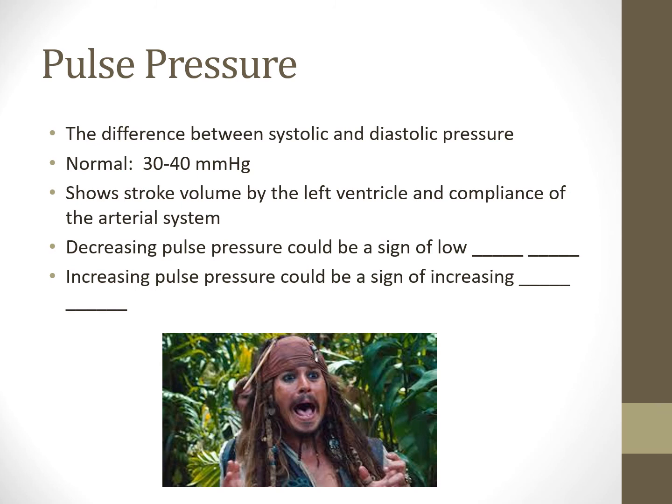So this means, especially with mechanical ventilation patients, I'm going to look at both the pulse pressure and the heart rate after and before I make any vent changes. Because if I increase PEEP, if I increase mean airway pressure, if I increase my tidal volume on this patient, then I could be causing a restriction on the vena cava and therefore decreasing stroke volume and decreasing hemodynamics.